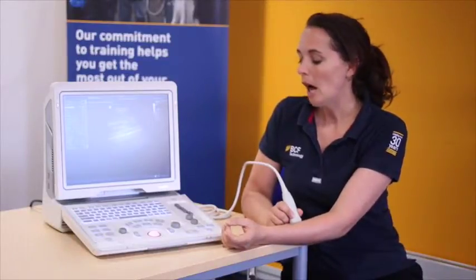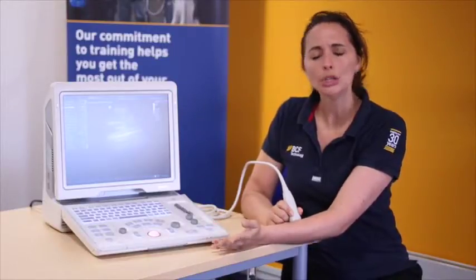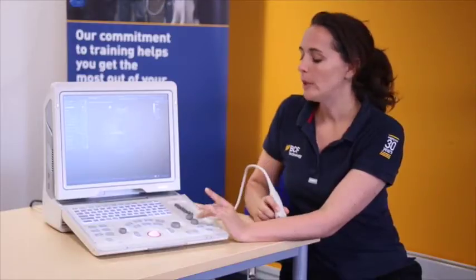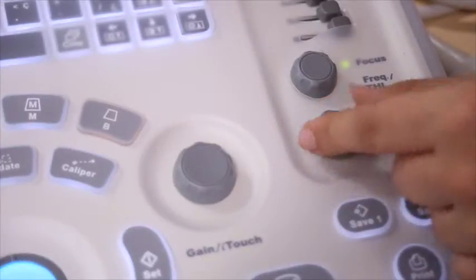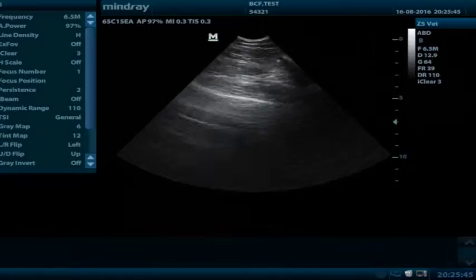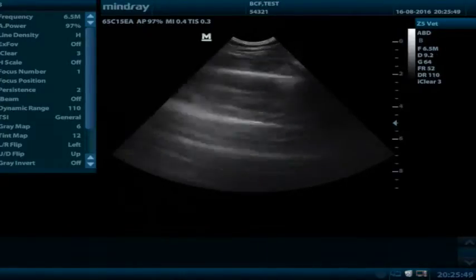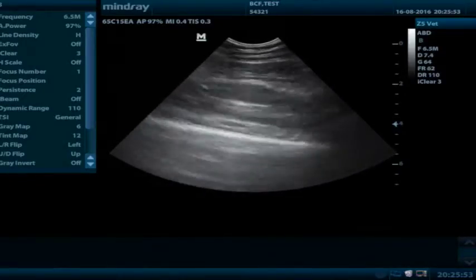Popping the probe on, I want to change the depth so that whatever I'm looking at takes up about two thirds to three quarters of the screen. For the Mindray, we use the bottom dial on the right-hand side of the machine. The little green button highlighted says depth, and when I rotate the dial, I can either increase or decrease the depth. What I'm looking at should take up about two thirds to three quarters of the screen — about there.